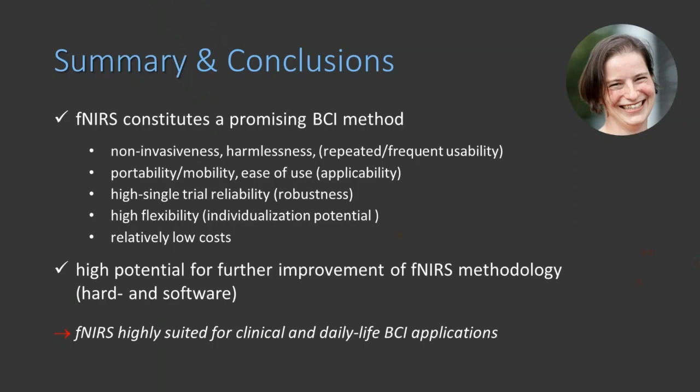So let's conclude. I hope I could convince you all that fNIRS constitutes a promising BCI method because of its non-invasiveness and harmlessness. It's really suited for repeated and frequent use, and especially portability, mobility and ease of use enhance applicability.